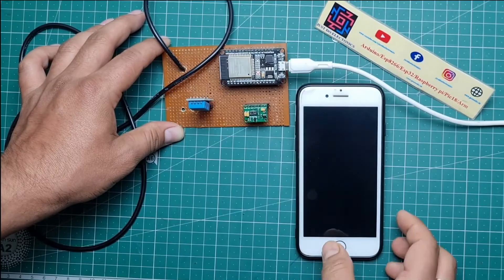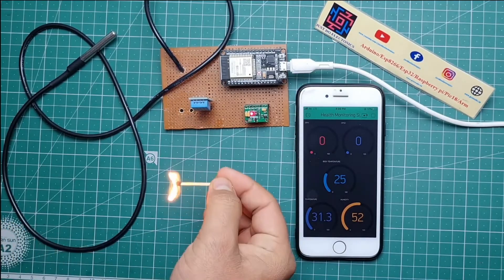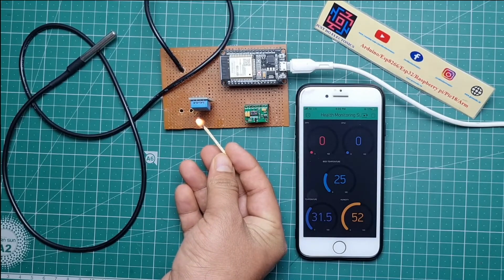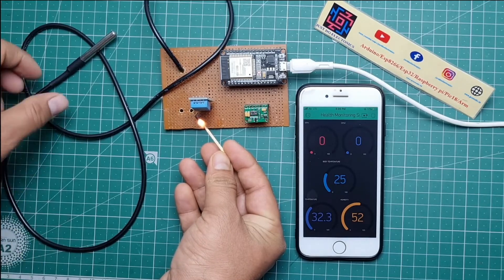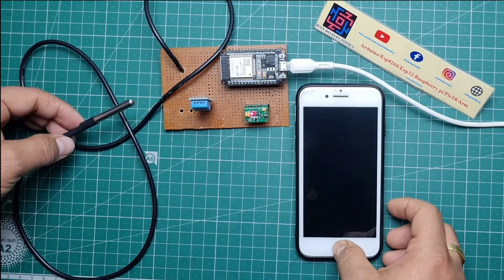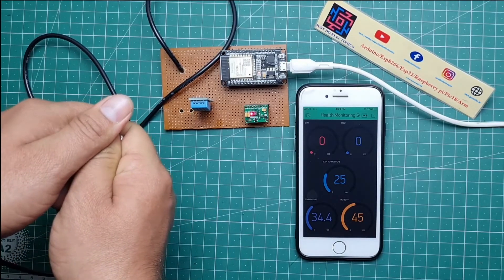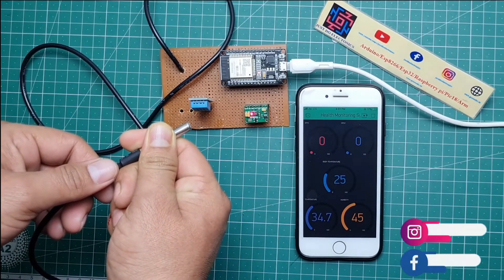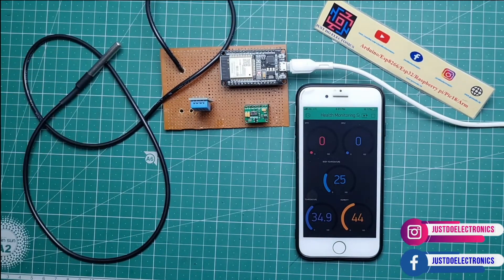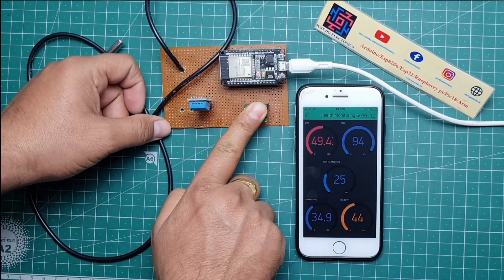If I remove the DHT11 sensor, the value goes to zero. When I put the DHT11 sensor back, the values return — right now it is 31 degrees temperature and 52 percent humidity. I am providing some heat near the DHT11 sensor and you can see the real-time data change in the Blynk app — now it is 33.3 degrees. The digital temperature sensor is also updating; it shows 25 degrees when I hold it in my hand.